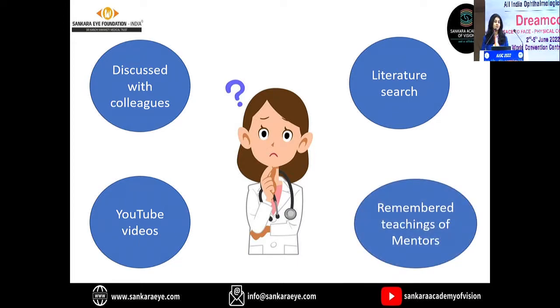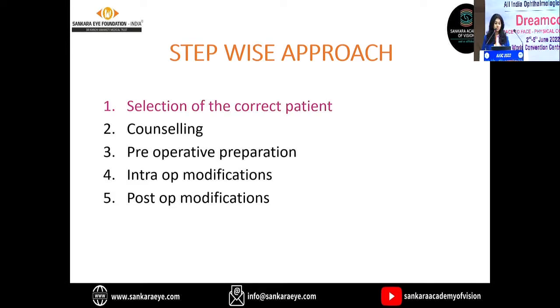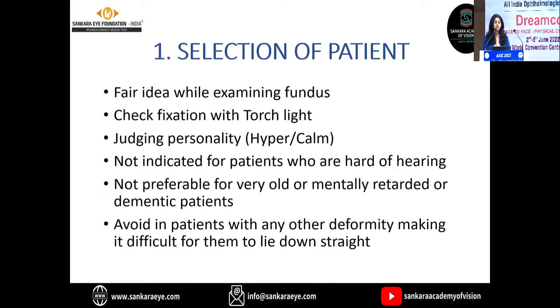And of course, this was a time where I had to put all the teachings that I had gathered during my training period into my practice. So I designed a stepwise approach: selection of the correct patient, counseling, pre-operative preparation, intraoperative modifications, and post-operative modifications. In selection of patient, this is a very important criterion. During the OPD, while examining the fundus itself, you get a fair idea whether the patient will be cooperative for topical or not. Many times the patient doesn't even open the eyes for a normal fundus examination on a 90D or a 20D. So that patient might not cooperate for a topical surgery.